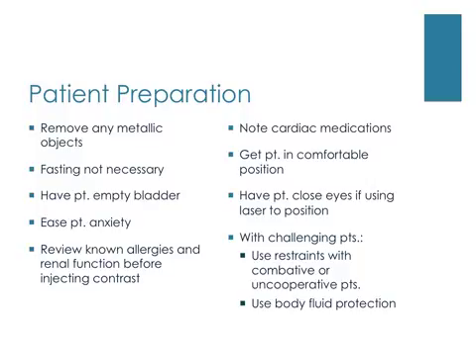You need to review any known allergies and renal function before injecting contrast to minimize reactions and also kidney impairment. Make sure you know any cardiac medications because these can indicate poor cardiac functions, which actually can be relevant during a CTA exam. You need to be able to get the patient in a comfortable position in case the exam takes a longer amount of time. Usually most scans don't take too long, but you do want to get the patient in a comfortable position.